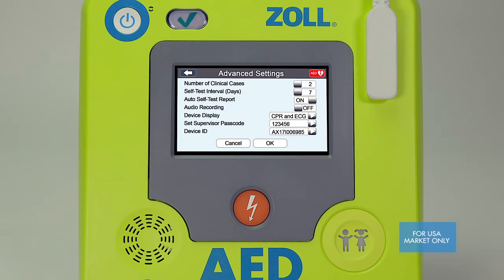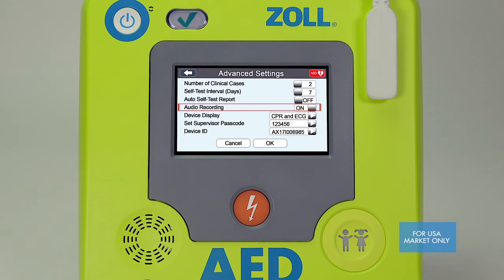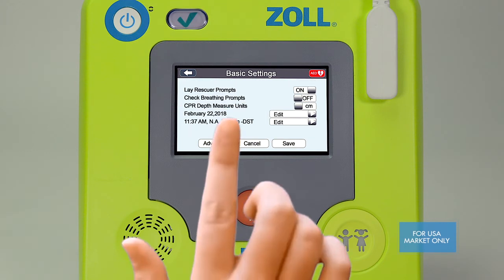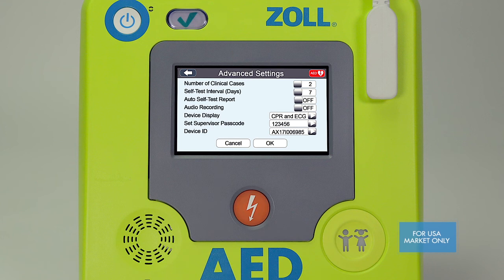In some instances, a responder's protocols may call for the use of audio recording when an AED is used in a rescue. The default setting for this feature is off because the majority of response protocols do not call for it. However, if your specific response protocols do call for audio recording, you may enable this feature by selecting on. Note that this feature is only available on the BLS model of the Zoll AED3.